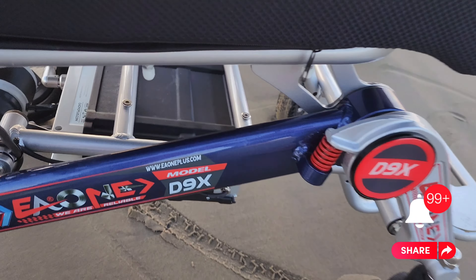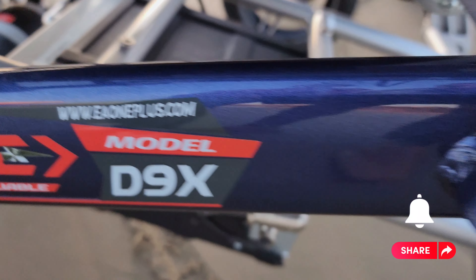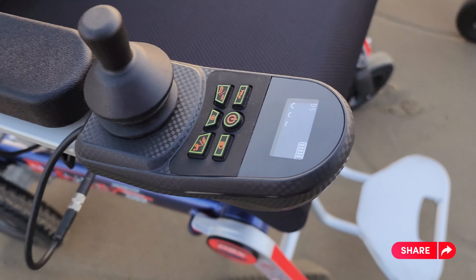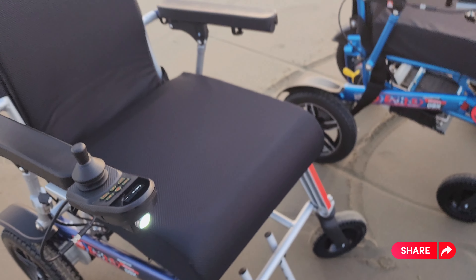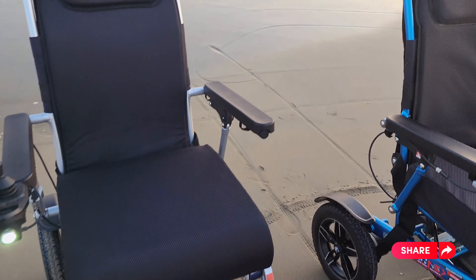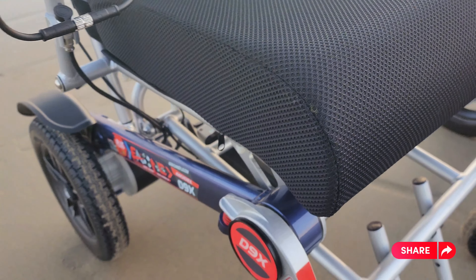We can walk on sand, snow, gravel — anything. Our colors are amazing; we have the best choices of colors you can pick. We have a new remote control that comes with a screen and it's very easy. Our cushion is very comfortable as well — it's a 4-inch thick cushion.